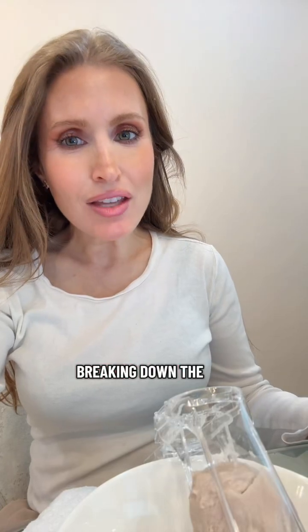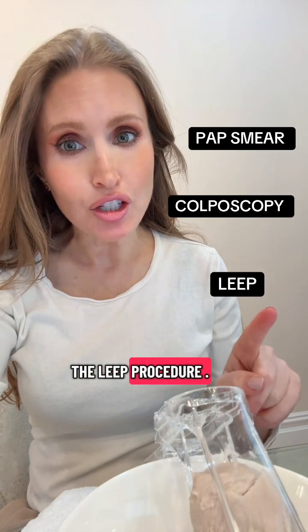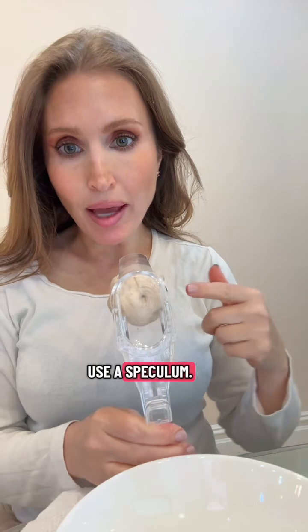Today, we are breaking down the differences between the Pap, the colposcopy, and the LEEP procedure. First, the Pap smear. As most of you know, this is a routine cervical cancer screening test. Your doctor will use a speculum.